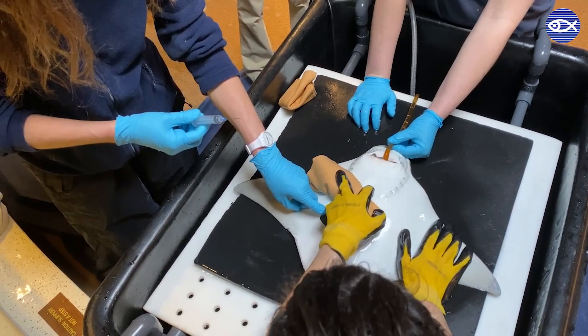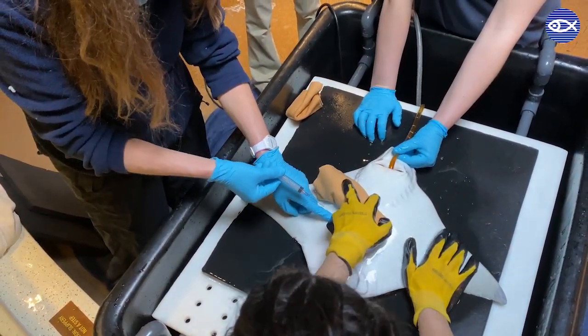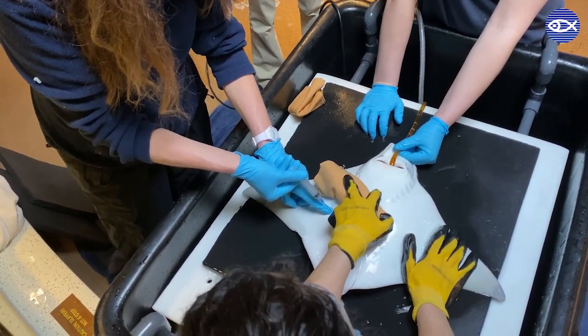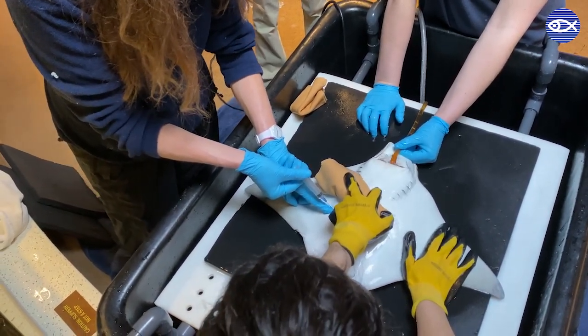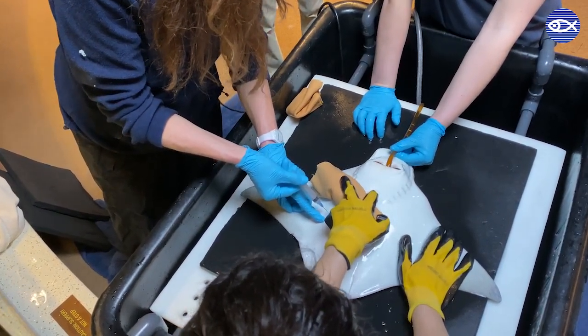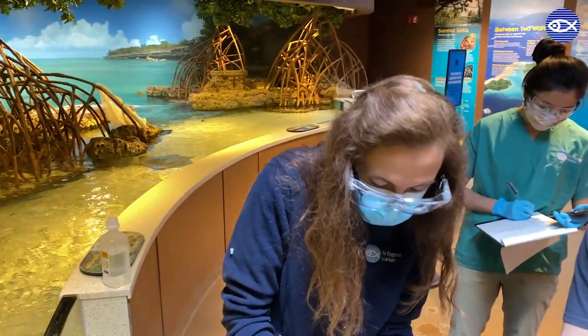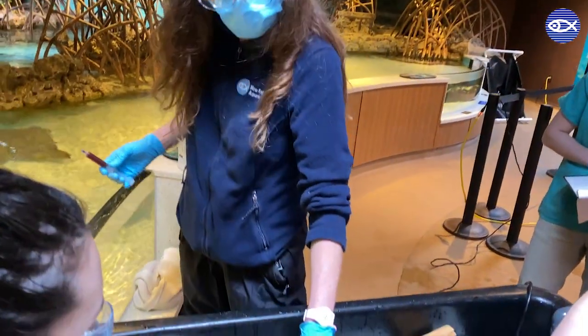Next, you can see me collect a blood sample from the ray. There are a few different areas where we draw blood from stingrays. This site is called the mesopterygial vein. After a clean draw, the blood is then placed in various tubes and labeled with this individual's ID number.